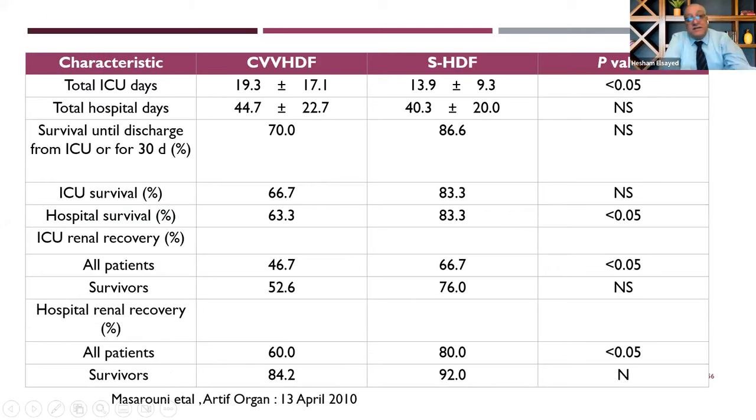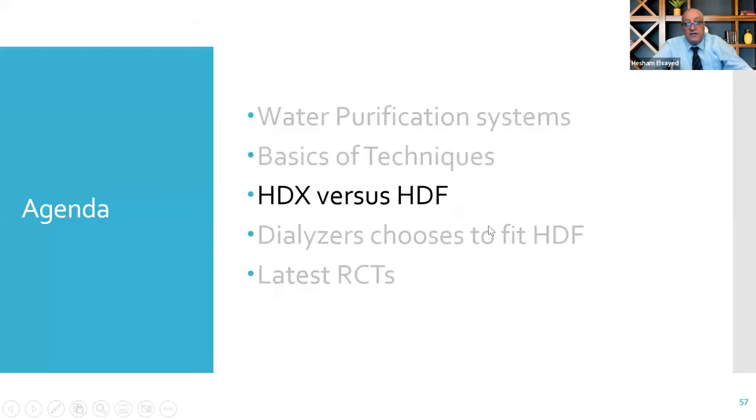So this is an additional option you may implement: hemodiafiltration in the ICU as an alternative pathway to the very expensive CRRT session. But some patients actually need CRRT instead because it may have the advantage of 72 hours continuously, and the dialyzer may absorb more of the cytokines or endotoxin, especially with the newly developed hemofilter used in CRRT. But it is an additional option: sustained hemodiafiltration.